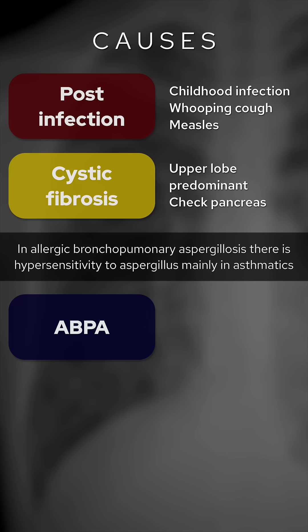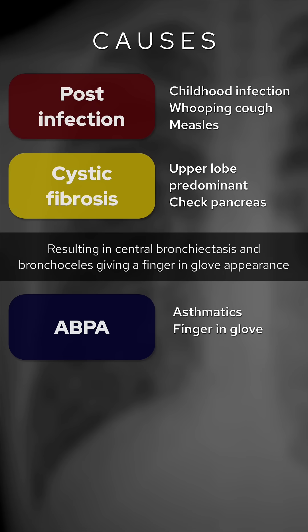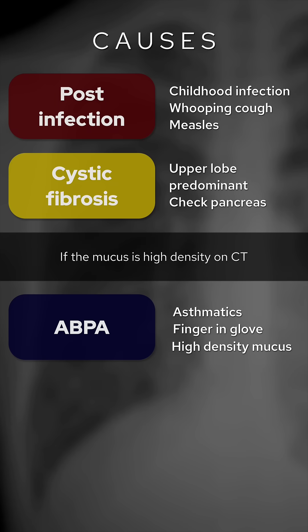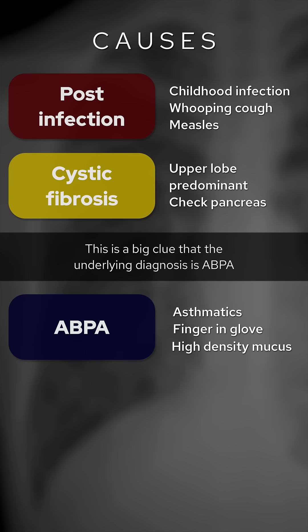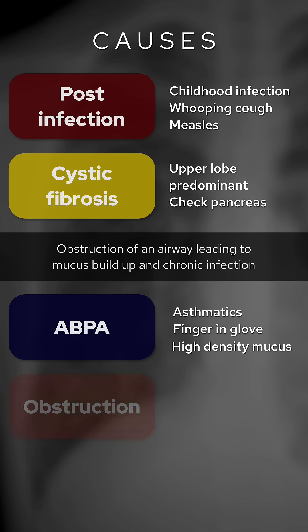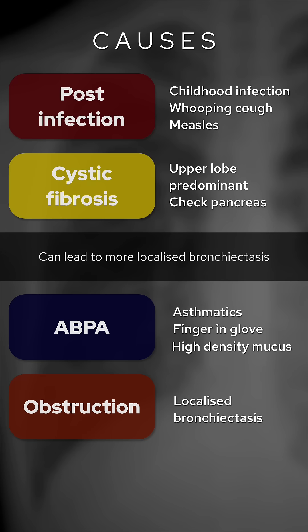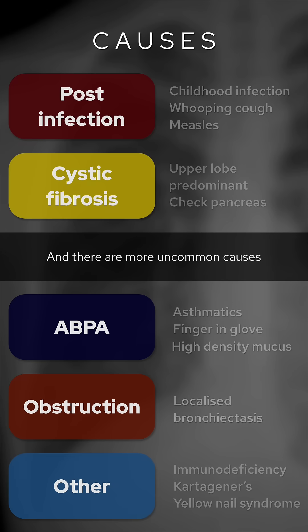In allergic bronchopulmonary aspergillosis (ABPA) there is hypersensitivity to aspergillus mainly in asthmatics, resulting in central bronchiectasis and bronchoceles giving a finger-in-glove appearance. If the mucus has high density on CT, this is a big clue that the underlying diagnosis is ABPA. Obstruction of an airway leading to mucus buildup and chronic infection can lead to more localised bronchiectasis, and there are more uncommon causes.